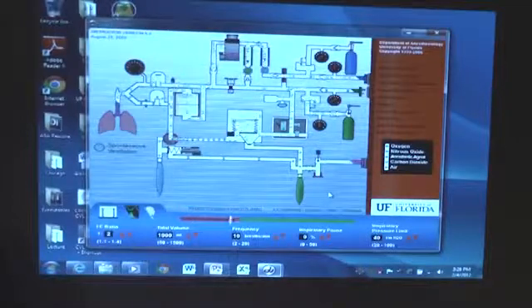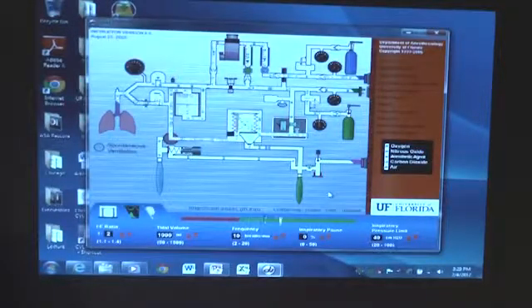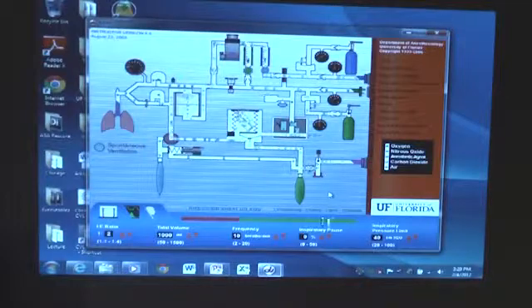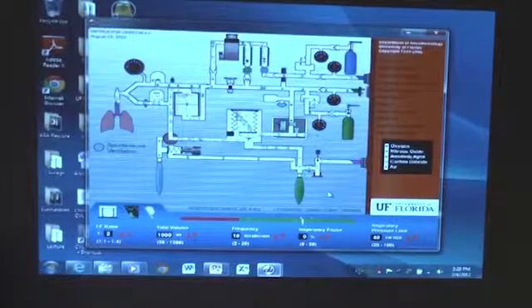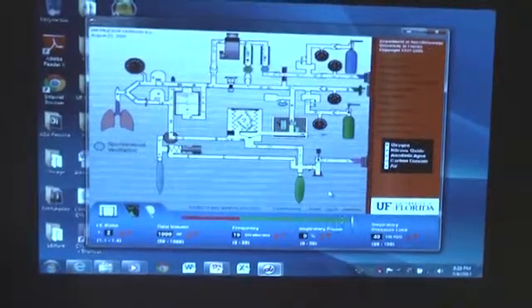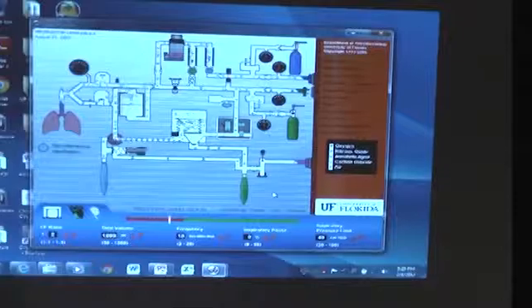When will you run out? Depends on the PSI of the tank, and your tidal volume and your gas flow. Okay, good. Keep going. So if you have 2 liters of gas flow and you have 8 liters of tidal volume, then it's 10 liters total, which depending on the PSI in your tank, will tell you how many. Does that make sense? No, it doesn't make sense. I think you've talked to some of your colleagues. Actually, I just read this last night. Okay, first of all, I think an easy way to think of this is like your bank account, right?